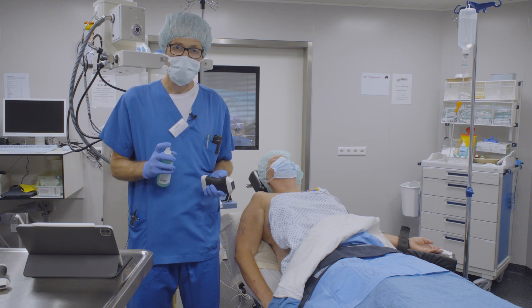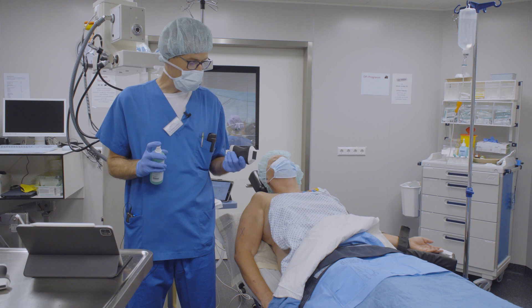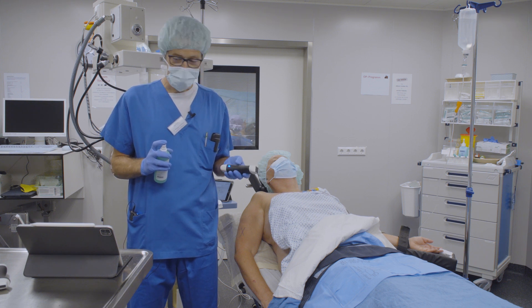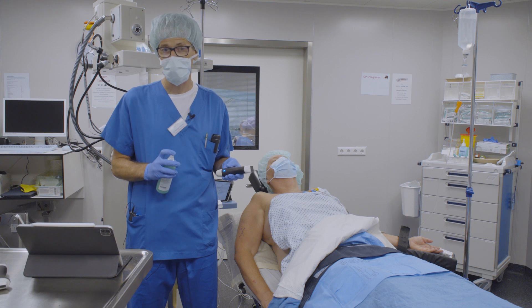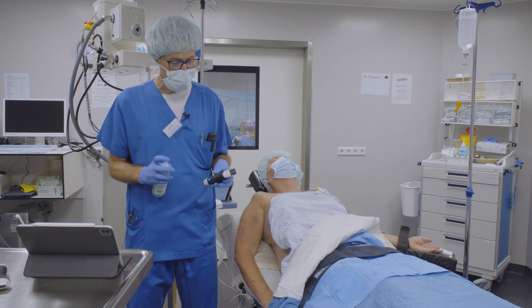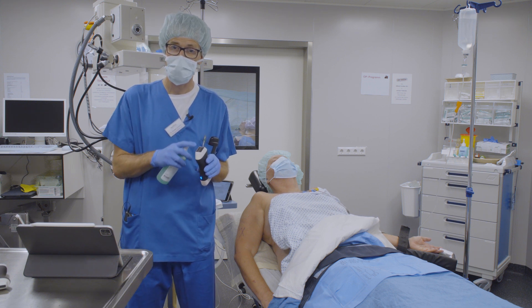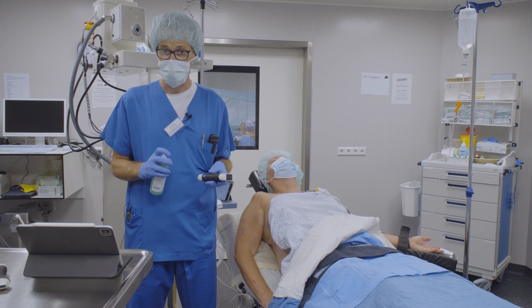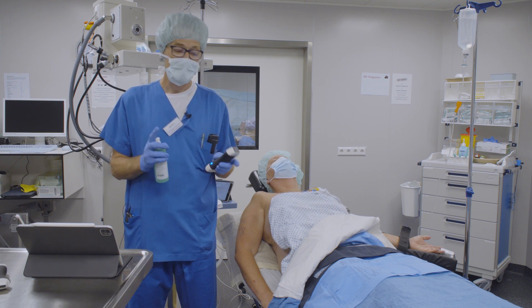We do this ultrasound-guided, and I've got a little probe here. This probe is quite cool because it connects with Wi-Fi to an iPad, which I use as an ultrasound monitor. And this one has another very special feature because it is a two-in-one probe. It has got one linear section and also a phased array, and depending on the preset, it automatically switches between the two.